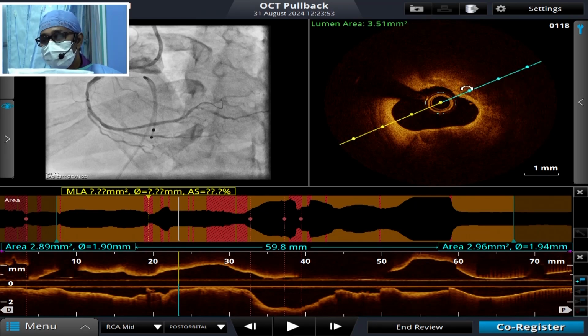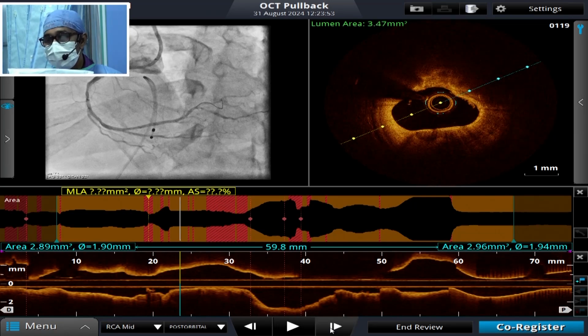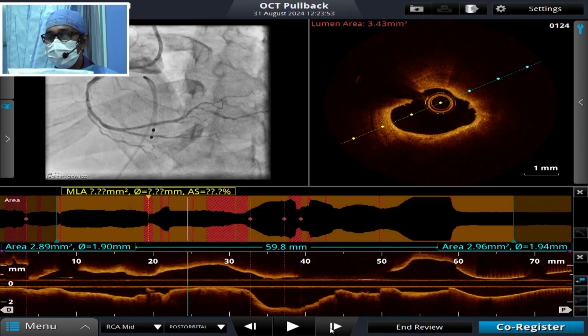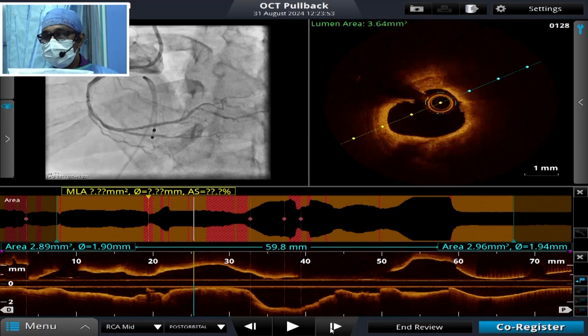Again you can see that this small bit of calcium has been sanded with the orbital. Now again you can see, at the 12 o'clock position and in every area, some amount of white thrombus-like material. Probably intimal disruption is seen. Certainly this has helped. At the 12 o'clock position there is a significant amount of calcification that has been polished.